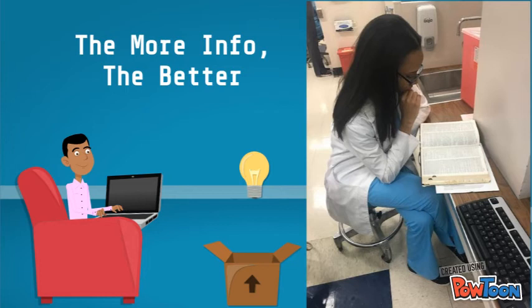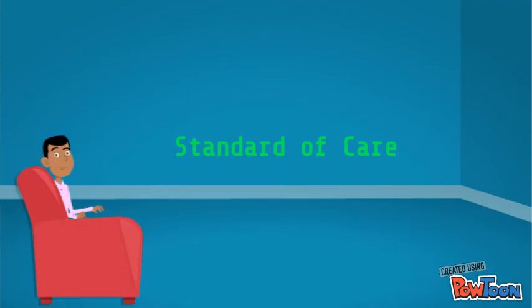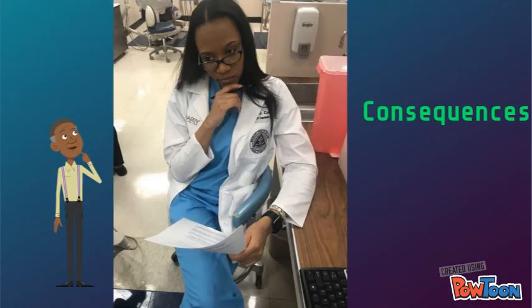Now this is important because this is not a contraindication for our treatment of choice, which is root canal therapy. Based on the patient's complaint and the patient's symptoms, the proper standard of care would be to perform some endo testing, which consists of thermal testing, percussion, palpation, and a bite test. Failure to treat this patient will lead to further decay, possible loss of tooth vitality, and increased sensitivity due to a high chance of pulpal exposure.